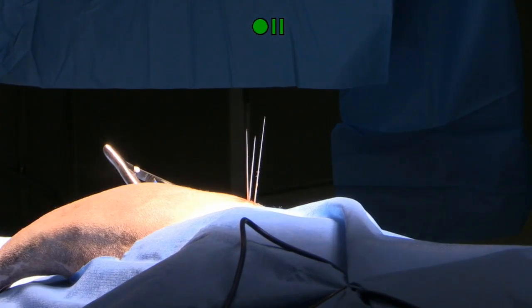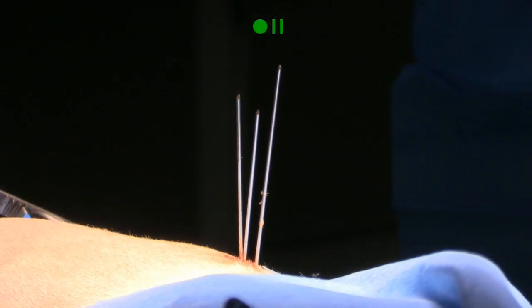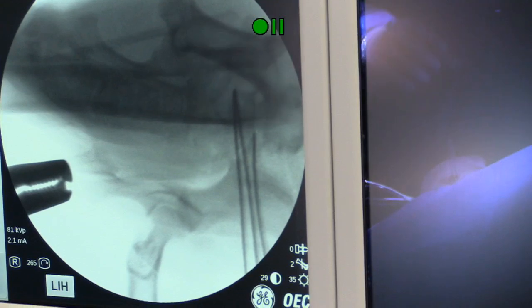That's the second pin that I put in there. One of the issues is if we put a bunch of pins in there, we can turn the bone into sort of Swiss cheese. So the first pin I'm pretty happy with. I'm just hoping to try and make it a little bit better, but I think on balance that first pin is going to be adequate for what we want to do.